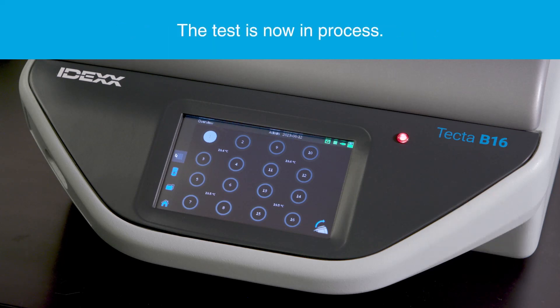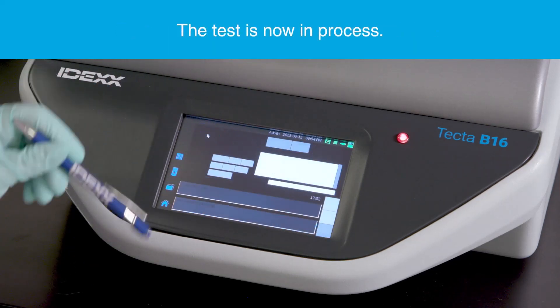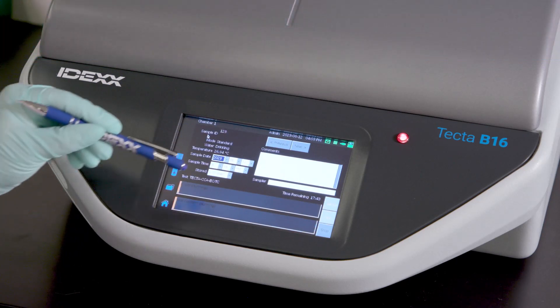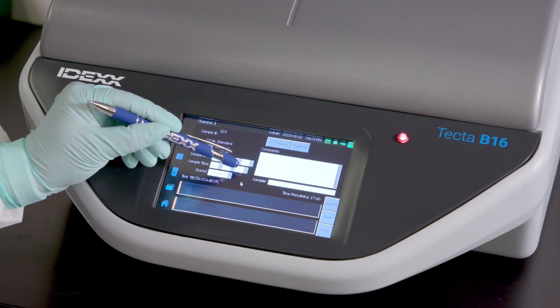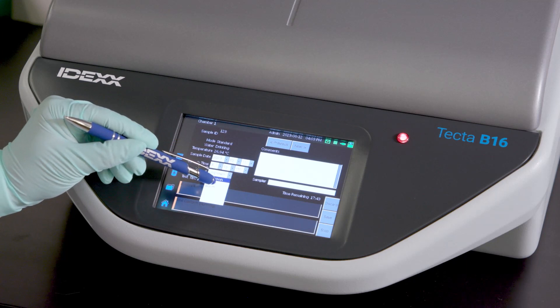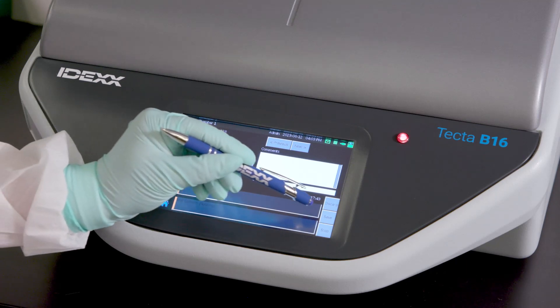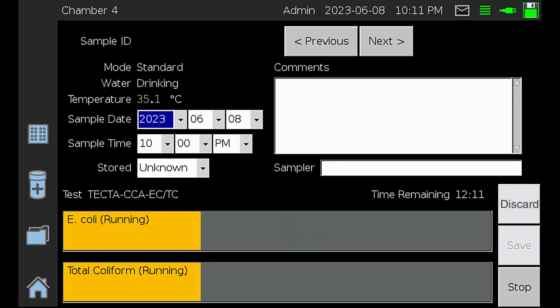While a test is in progress, you can select the chamber for a status update or add more sample details. Additional sample details can be updated on this screen. After updating details, either press Save to save changes or Discard to discard changes. Note that sample ID, test type, and temperature cannot be changed once the test has begun.